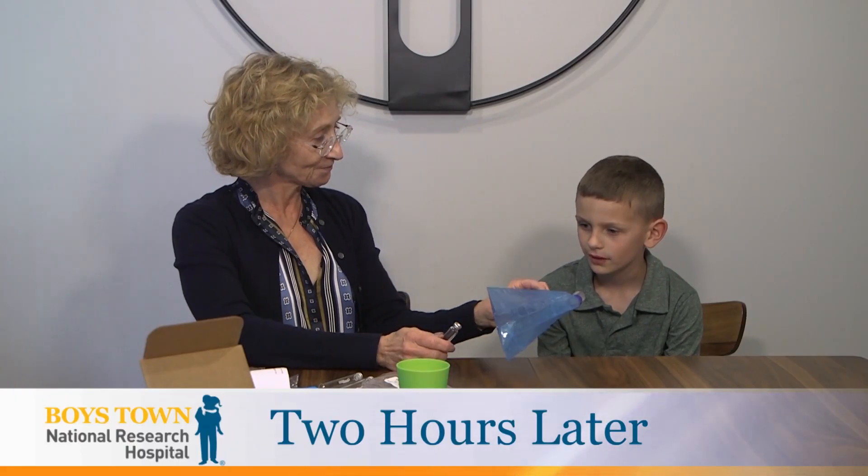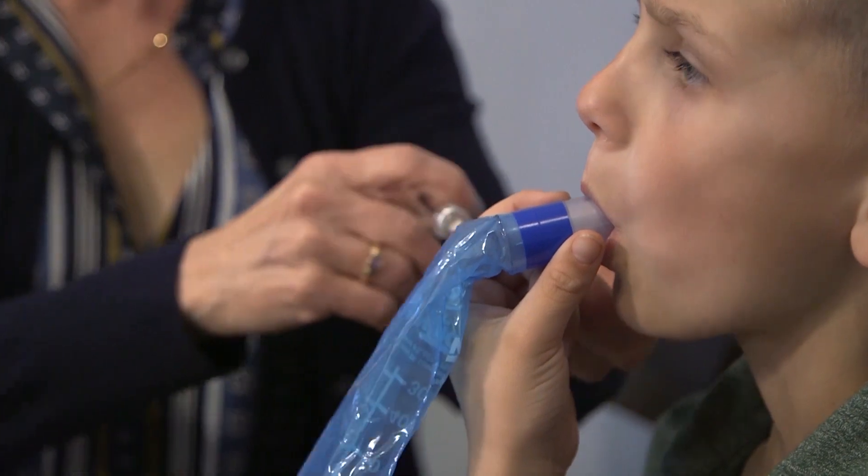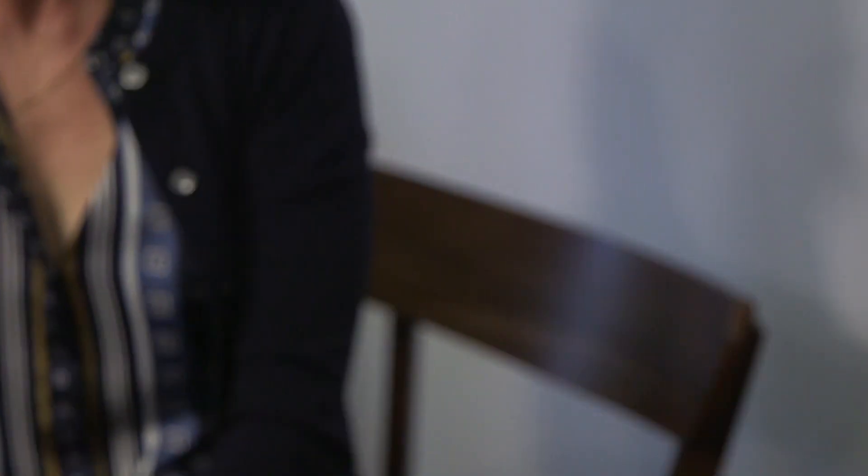Time for our third sample. We repeat the same procedure — start blowing and keep blowing. You're doing an excellent job. Make sure when you blow, you're blowing as hard as you can blow. You don't have to take a deep breath, though.